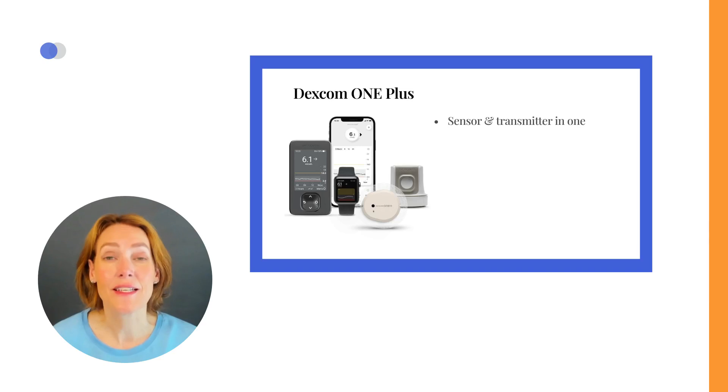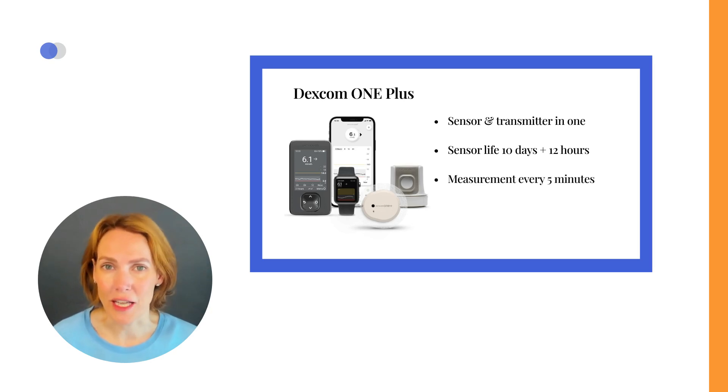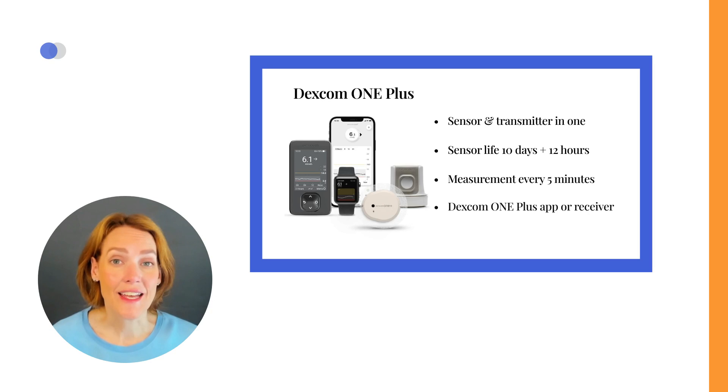The Dexcom One Plus combines a sensor and transmitter into a single device, providing continuous glucose monitoring that lasts for 10 days with a 12-hour grace period. This advanced sensor measures your blood sugar levels every 5 minutes, and you can easily access this data on your compatible mobile phone or on a Dexcom One Plus receiver.